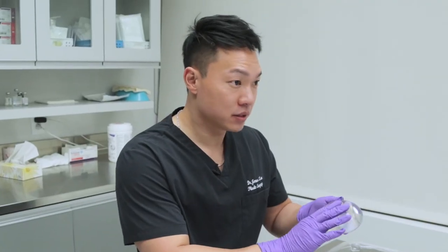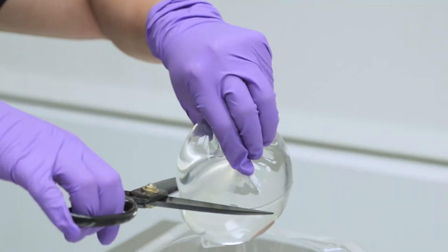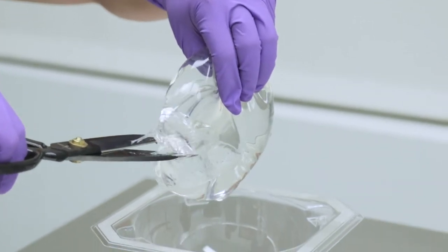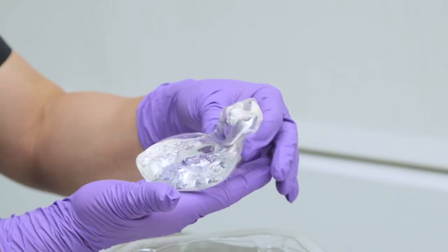So now we're going to cut the silicone cohesive gel implant just to show you what silicone gel looks like. As you can see, it still keeps its form and it's not leaking silicone.